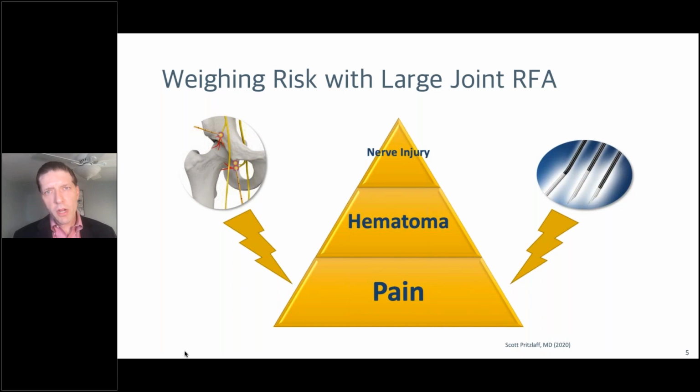Next slide, please. So we'll start momentarily just talking about the knee, but the question is, with any of these procedures, what are, one, some of the things that I've seen and experienced, and two, what are the theoretic risks? I always tell patients that they should expect that they may have pain for upwards of a week after a denervation, because, and this really depends on the system that you're using, whether it's a larger lesion size with cooled RFA, or you're using some permutation of a bipolar or tripolar lesioning technique, there is collateral damage. And so I let patients know that pain is always possible.